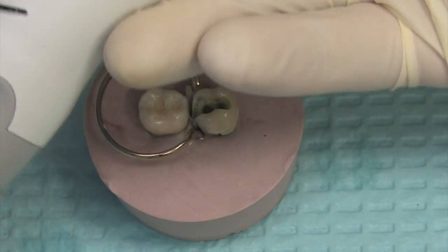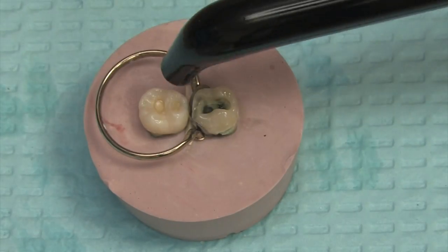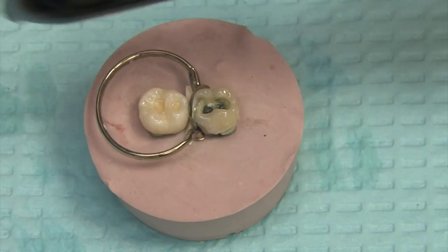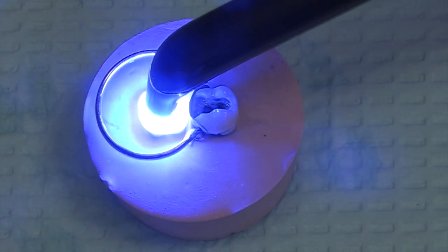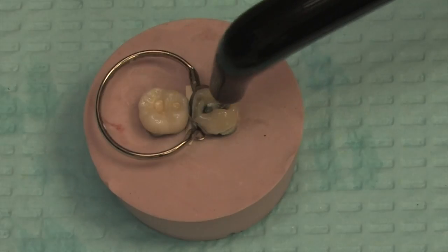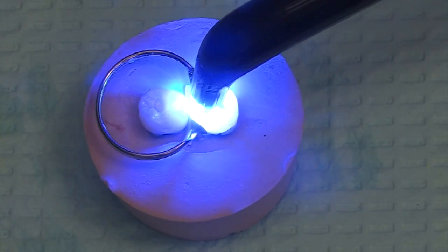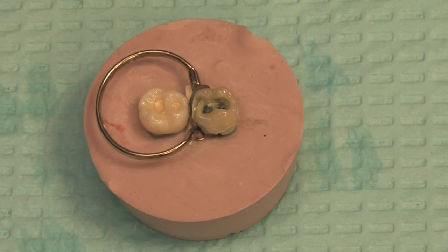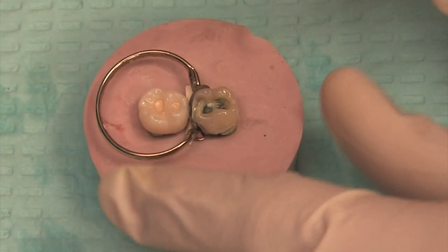Now it's time to cure. We use the Demi Plus, which comes in a couple different cure time lengths. I'll set it on five seconds and cure each tooth, just hovering right over the tooth about one millimeter away from the surface. I try not to touch the actual tooth surface but keep it close. If you remember from physics, the further away you carry a light from the target, the less energy reaches that target — so keep it close to the tooth.